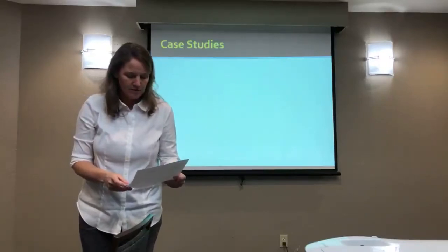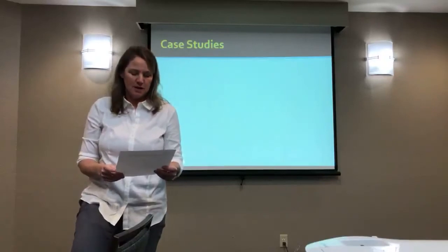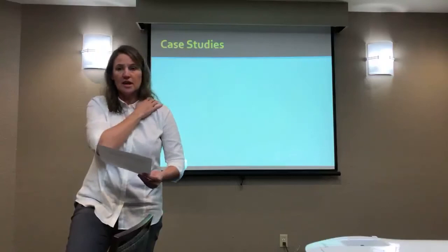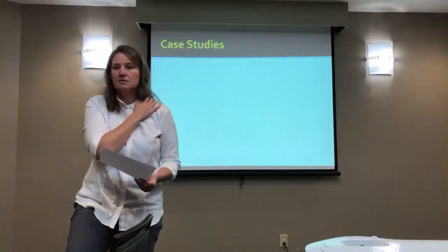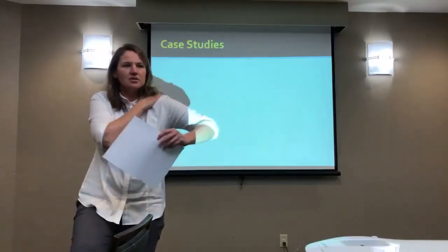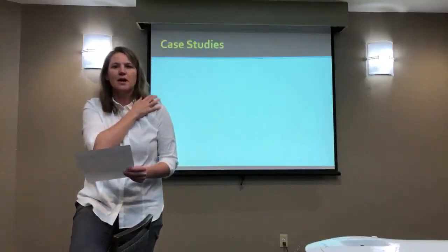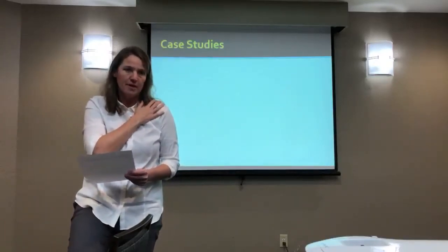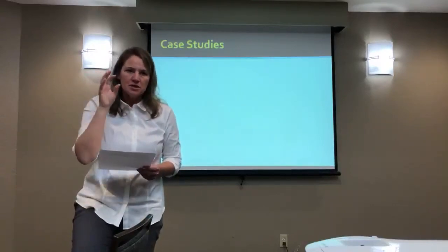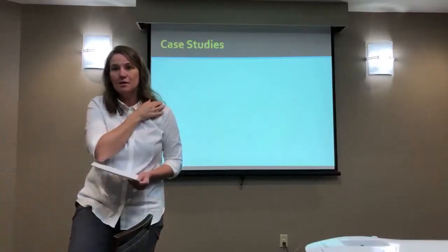Okay, so position. To me, I'm thinking comfort, maybe stretch, to try to get blood flow in the area, and then you could get creative. You could be doing some movement, have them actively contract once in a while, or address whatever they're lacking, if they have a postural problem or a range of motion problem. Anytime I say chronic, this person has a chronic problem. Why is it chronic? And could me doing a little treatment make it better?